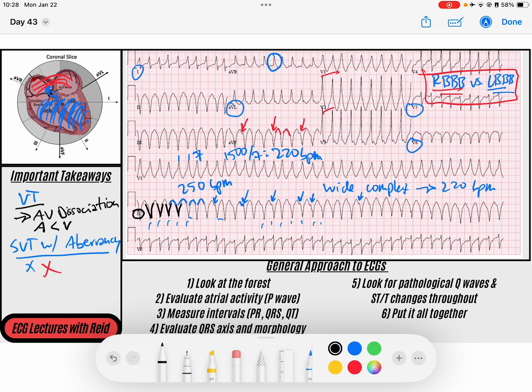And so what is our diagnosis based on the evidence that we just showed? We've got ventricular tachycardia. And then you can even make sure that you get more specific with this rhythm and you can call this a monomorphic ventricular tachycardia. That means that our QRSs are staying the same in their morphology every single time, which tells me that there is a single focus within the ventricle that is likely causing this ventricular tachycardia.